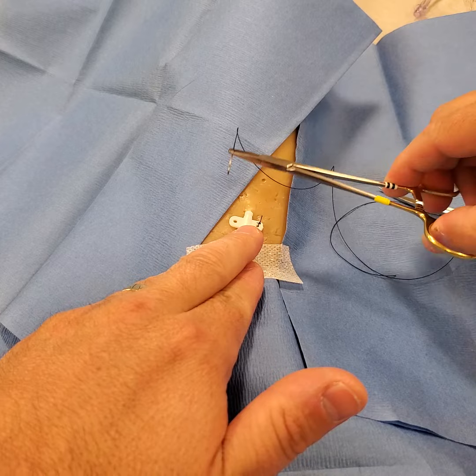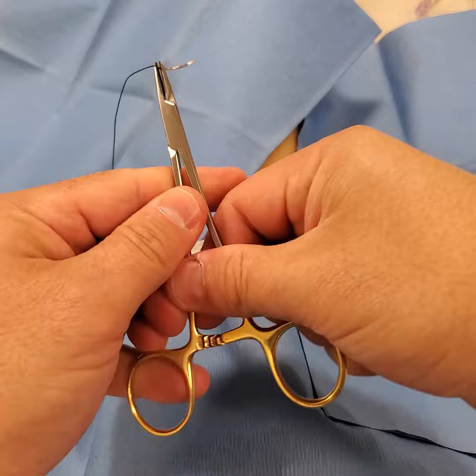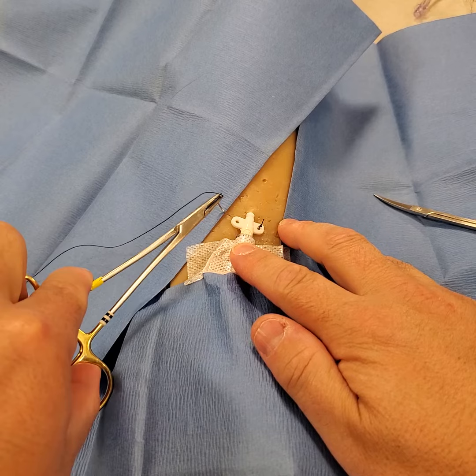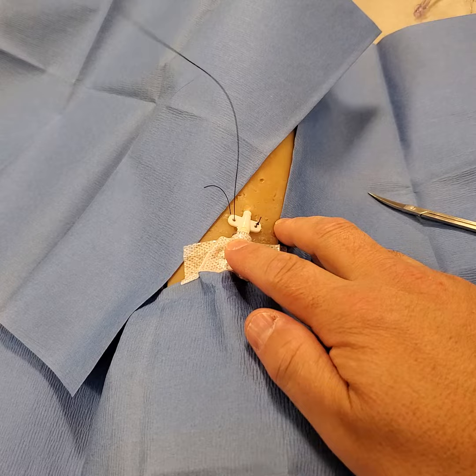So I say, trust in the force — use your left hand to initiate going through. That way, your hands are separate, they're not crossing, and your chance of actually getting a needle stick is much lower. So again, my preference is to start from the outside working in, give yourself a couple of inches, and drop the needle.